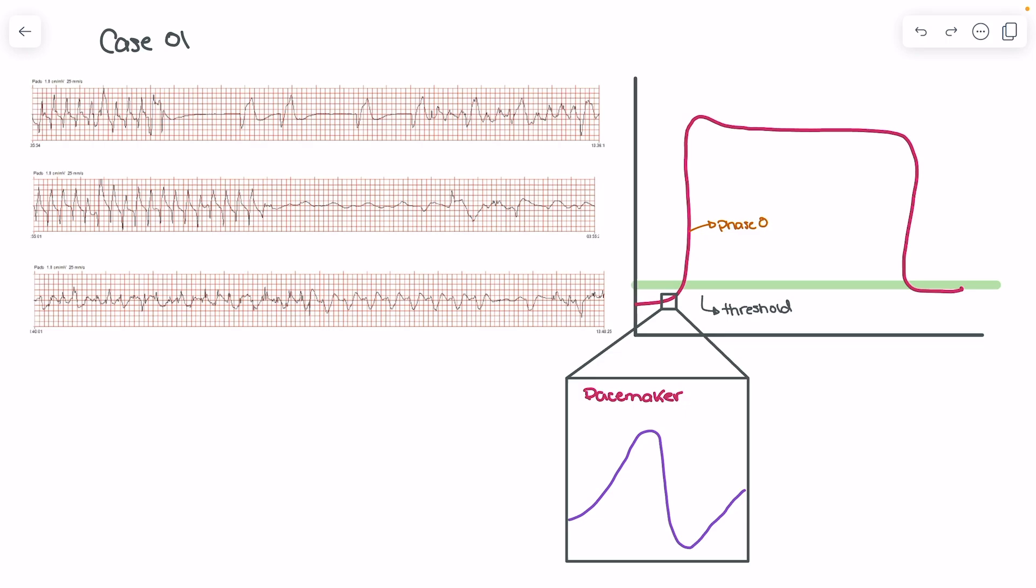When we look at rhythm interpretations one and two, so we have rhythm interpretation number one here and number two here, what we find is that we have a slow wide rhythm. So in rhythm interpretation number one here, the rhythm is quite slow and we have a wide complex QRS. And in rhythm interpretation number two, we have actually a much more characteristic sine wave.